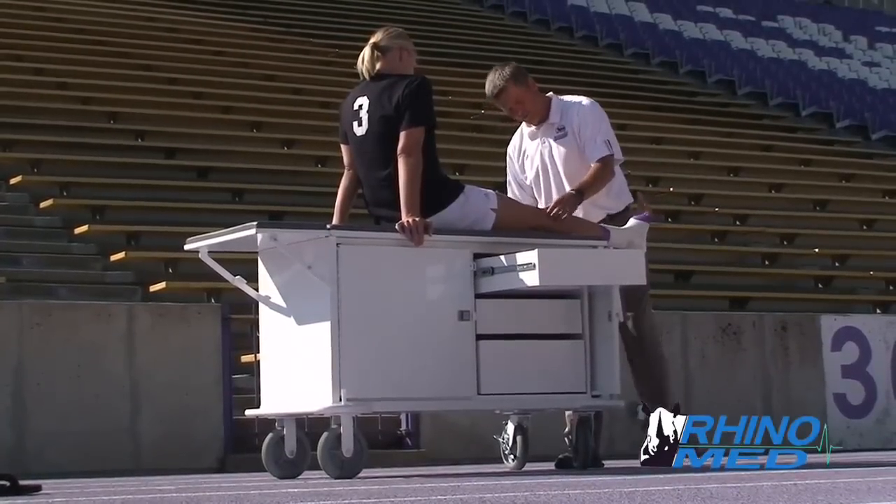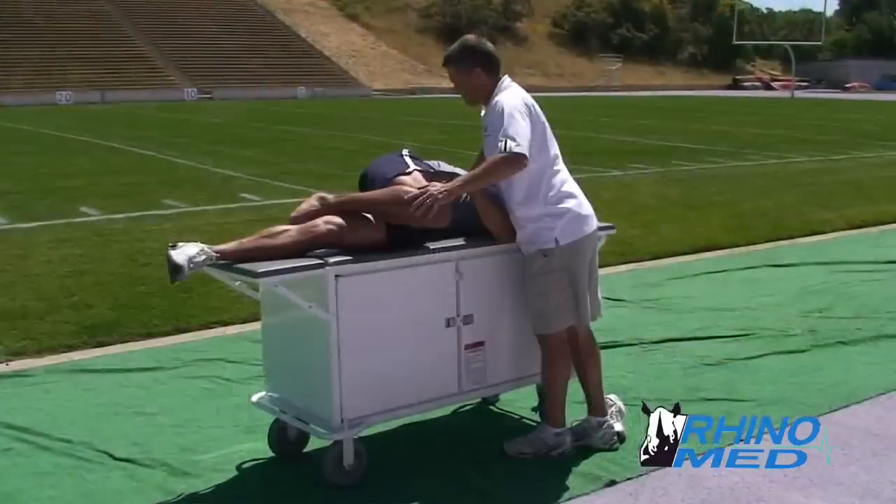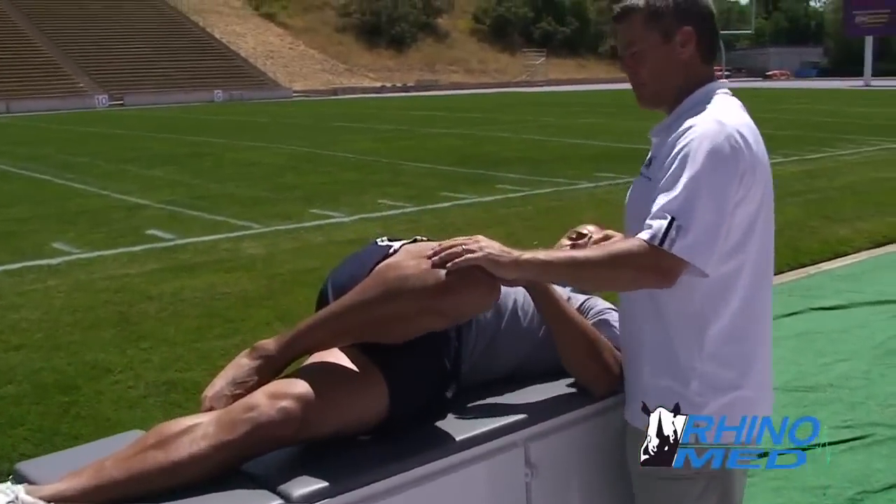Designed by a certified athletic trainer, the RhinoMed cart is built to make evaluating and treating athletes easier.